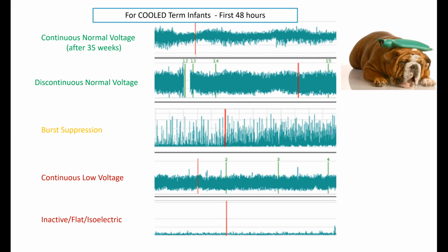And you asked about anti-seizure meds. So for anti-seizure, for phenobarb, typically, when you have a sick brain, all of these meds make havoc in the brain. So when you give an anti-epileptic, it does usually drop the voltage.